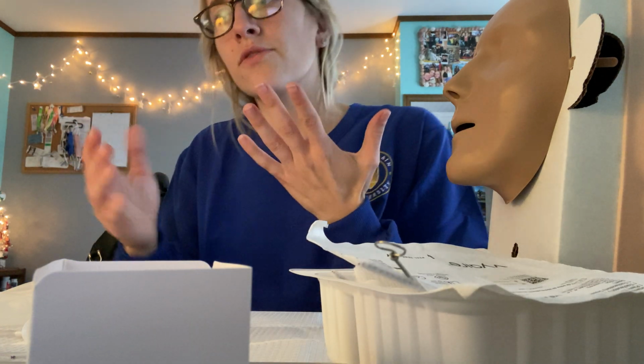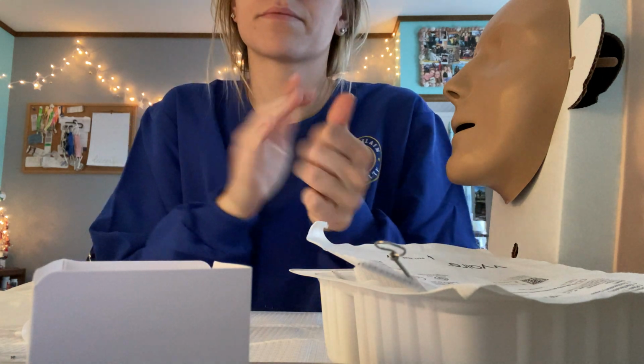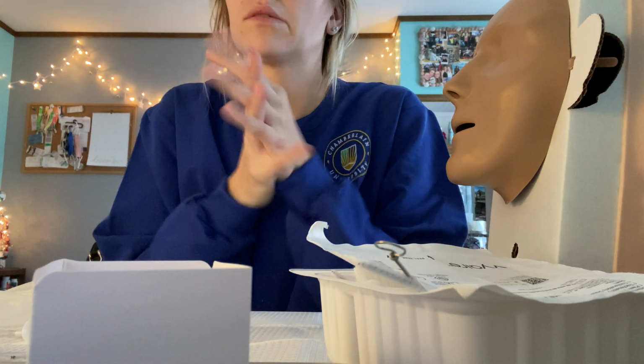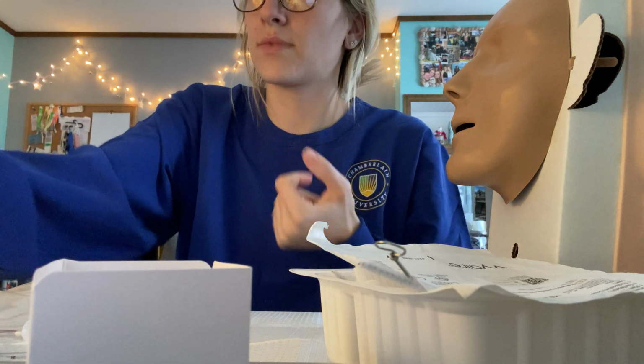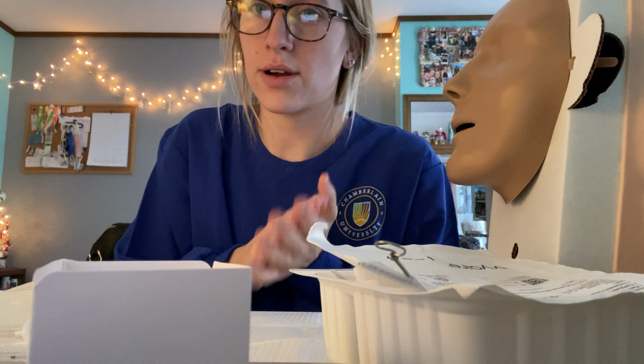And then also, of course, I'd always do hand hygiene. I would make sure the bed rails are raised up, bed is in the lowest position, the call light is in reach. And then I just perform my hand hygiene. And then I'll thank them for cooperating with me in the procedure, and then I'll assess if they need anything else or how they're feeling, and then they'll tell me, and then I'll say all right, thank you, and I'll be done.